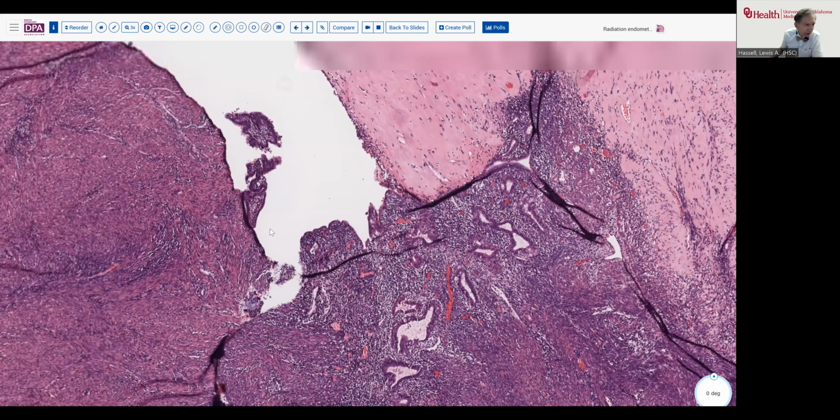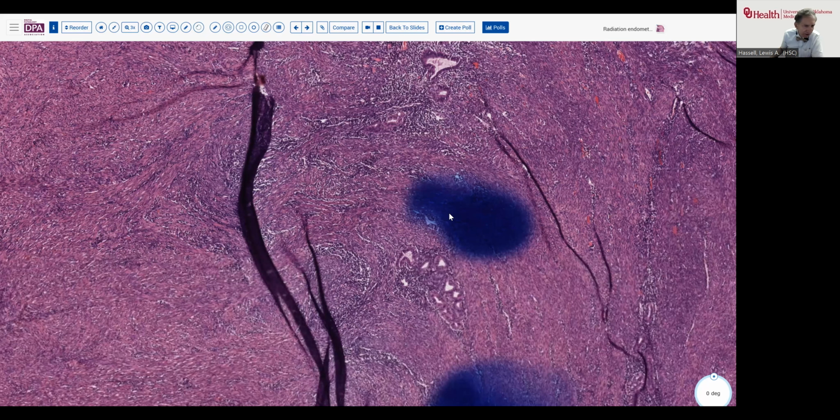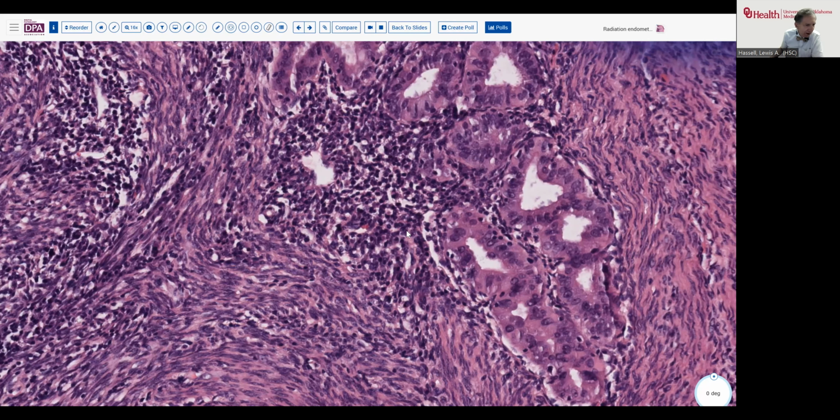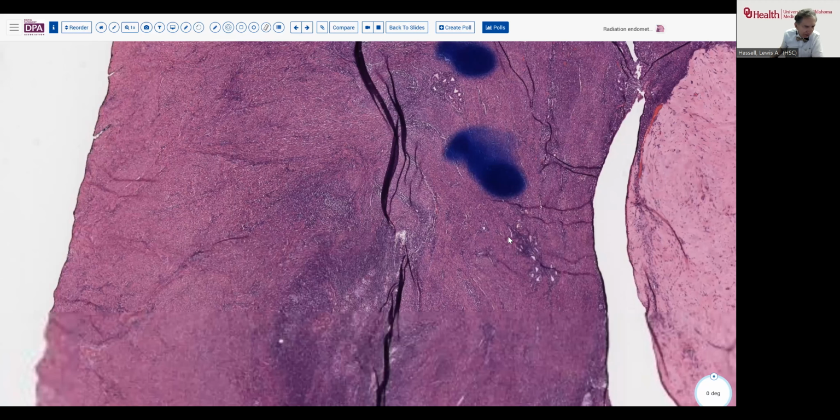We look at this fairly carefully and section it thoroughly, of course, to identify anything that looks like it might be neoplasia. This raised some concern on the part of the resident because of the small size and close spacing. But I think there probably is stroma around these. So these are probably just adenomyosis type glands that are slightly altered by the radiation changes. And we can see other areas of adenomyosis changes down here as well in this lesion.